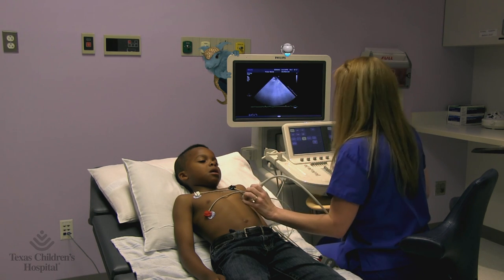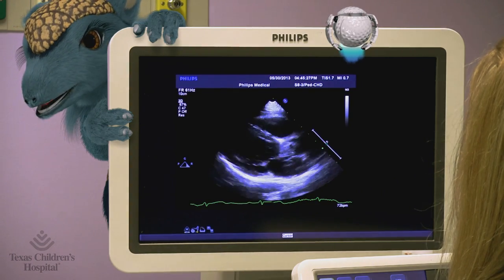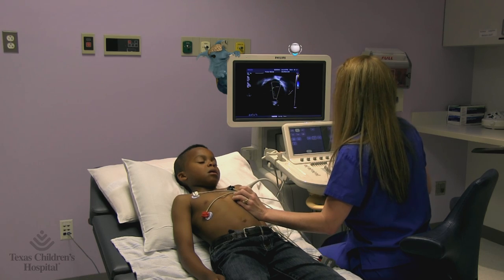Now I'm going to move over here and take some pictures. This is from a different angle. Now it looks more like a heart, right? That's the red bit. See the color change?